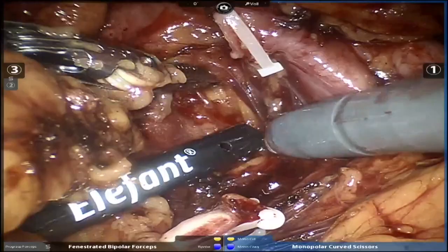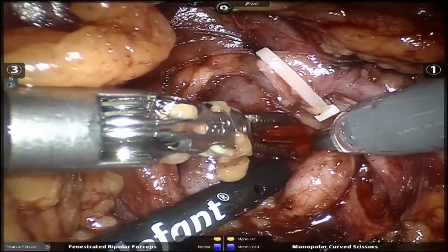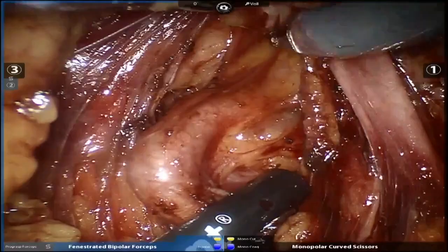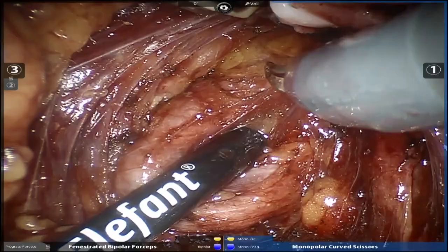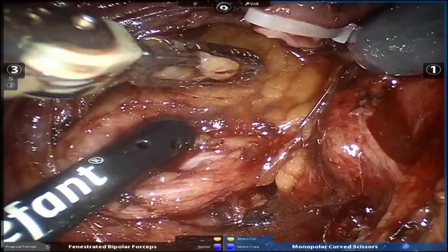I just don't know what this is. It's interesting. Yeah, we have an unusual vessel here, and I need to find out what it is. And I will. This would be a really nice case for ICG, for sure. I think we could give ICG, not clamp this vessel, and see what it's perfusing. What's perfusing, right.